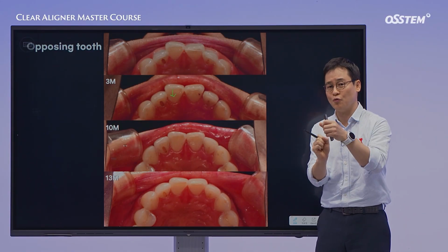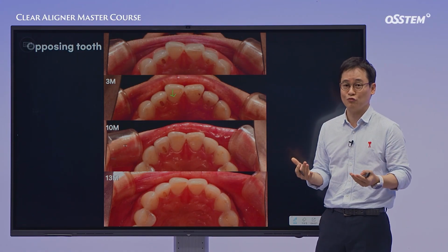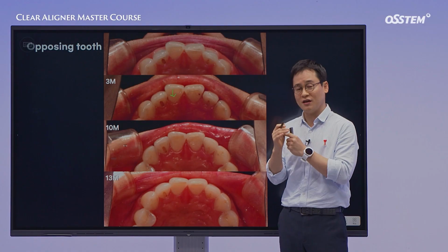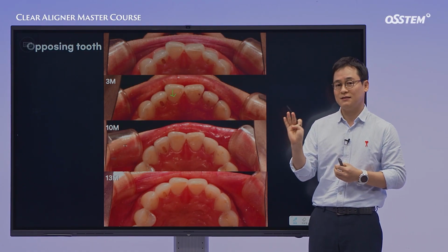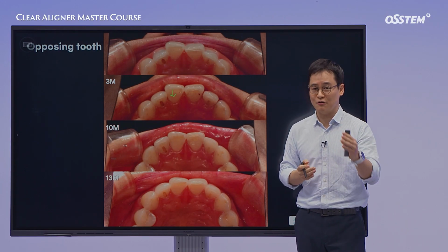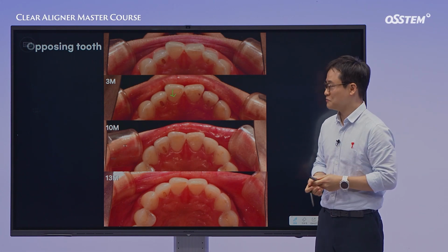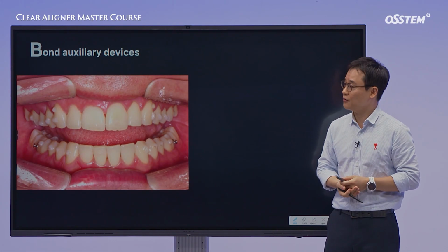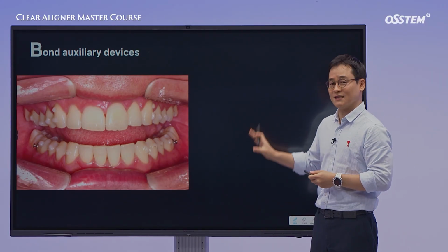Timing is crucial. Mandibular space needs to be created first before maxillary movement occurs. Simultaneous movement of both arches is ineffective. So sometimes the desired tooth movement doesn't occur because of contact with the opposing teeth. That's why it's important to check the interdental space and the opposing tooth. I recommend solving that issue first, then taking a new scan and ordering the next aligner.